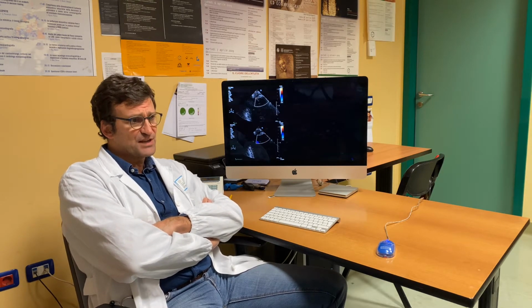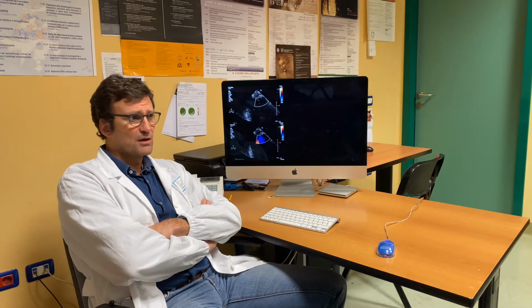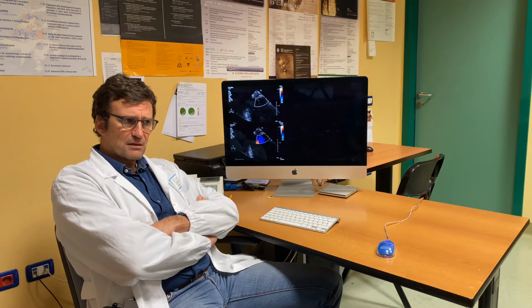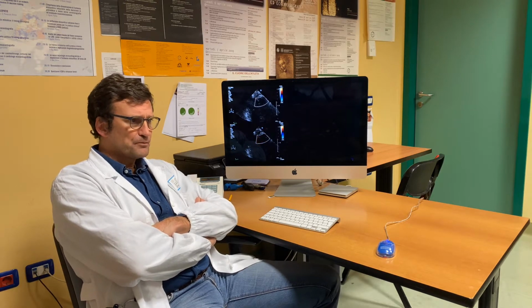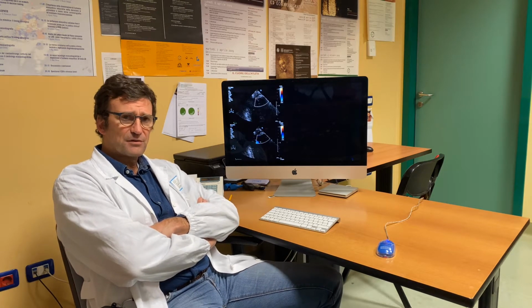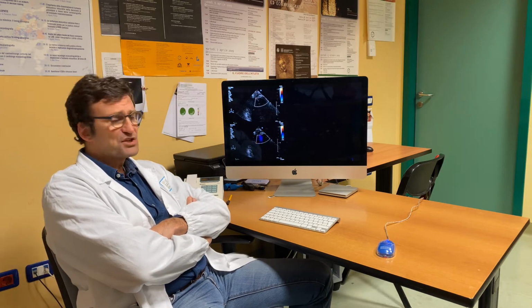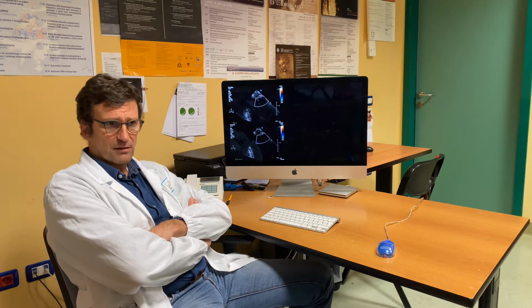It is more sensitive as far as diagnostic yield, and it helps you investigate the microcirculation and not only the epicardial. So it's kind of an addition of both the epicardial district and the microvasculature.